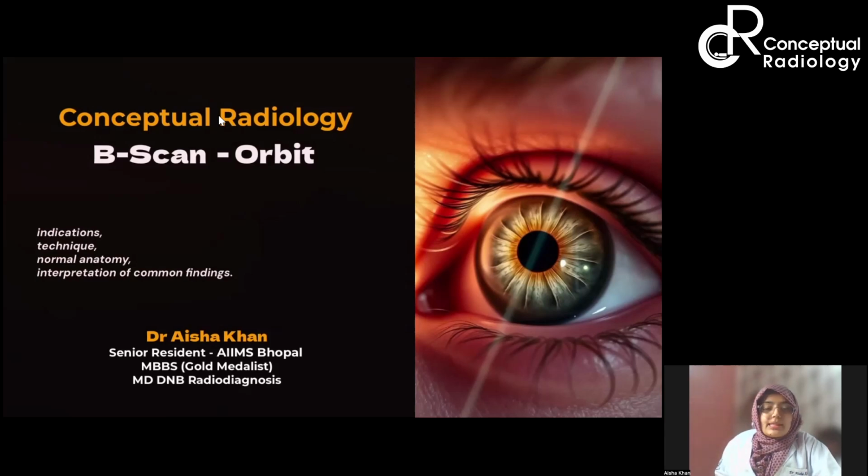So today's topic is based on B scan imaging of orbit. Okay? I'm sure some of you might have this as your thesis topic also, and it's a really cool thing. If you get a little bit of a hang over this, it becomes really interesting, and there are a lot of pathologies that you can diagnose using B scan.